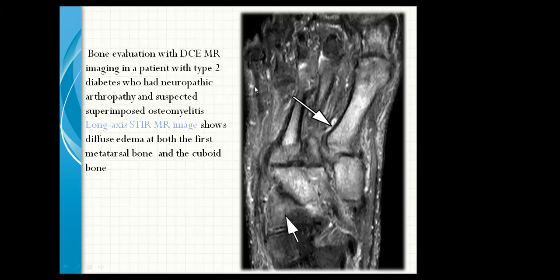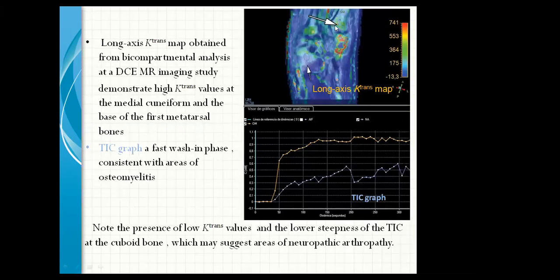Bone evaluation with dynamic contrast MRI imaging in a patient with type 2 diabetes who had neuropathic arthropathy and suspected superimposed osteomyelitis. Long-axis STIR MR imaging shows diffuse edema at both the first metatarsal and the cuboid bone. The Ktrans map obtained from bicompartmental analysis of the dynamic contrast imaging study demonstrates high Ktrans values at the medial cuneiform and at the base of the first metatarsal. The TIC graph shows fast wash-in consistent with the area of osteomyelitis, while the lower Ktrans value and lower steepness of TIC at the cuboid bone may suggest an area of neuropathic arthropathy.